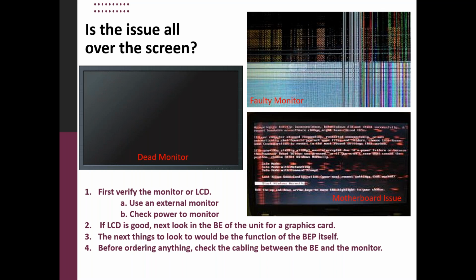And then you know you've got a faulty display or a dead display. And in the event of a dead-looking monitor or a blank-looking monitor, I would first check the power to the monitor before I went any further. Make sure that the power cable is seated in there tightly. Make sure there's actually the normal amount of power, whether it be DC. A lot of these LCD displays are 24 volts DC or 18 volts DC. I would check that before I moved on to anything else.